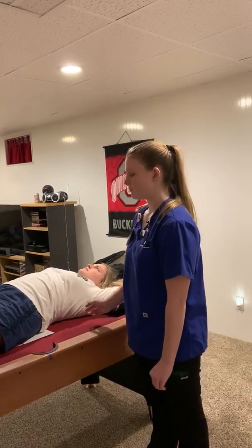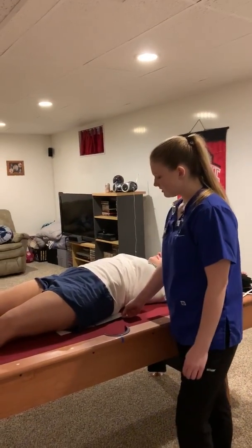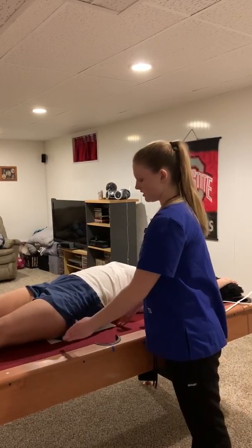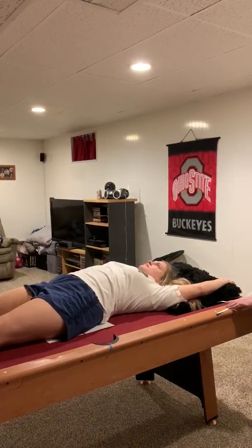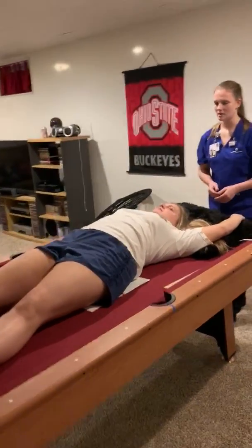And then I'd go ahead and lay her down on the table, and I would get a 14 by 17 inch cassette, and I would place it into the table bucky. But since we don't have a table bucky here, I just put it underneath her for now. And then I would have her lay straight and make sure that she's not crooked. So I'd come over here and make sure she's straight along the table.